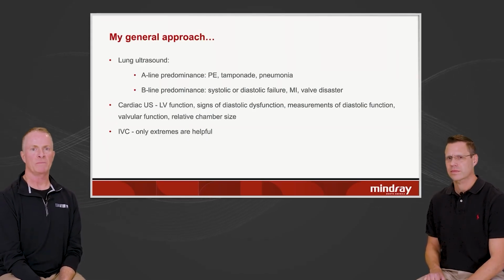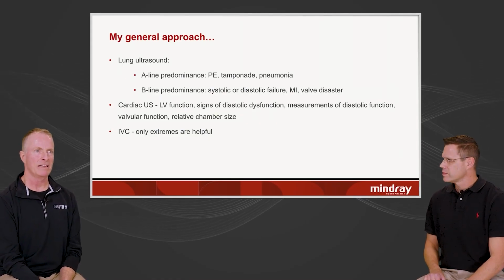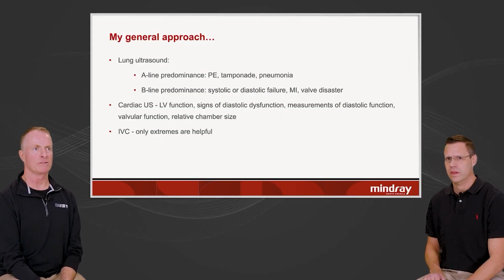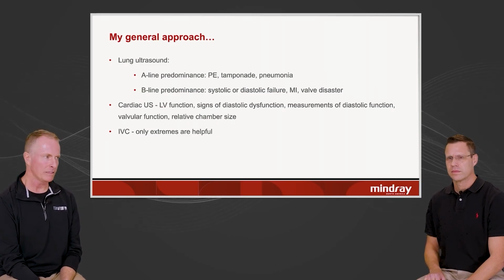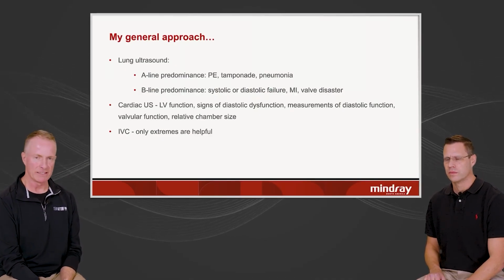If someone shows up to the ED and they have acute dyspnea as their complaint, and they don't have B lines, they have just some scattered B lines way at the bases, that's not their problem. If they showed up for dyspnea and pulmonary edema is the problem, they'll have B lines everywhere. So it won't be subtle. And the chest x-ray readings are just all over the place.